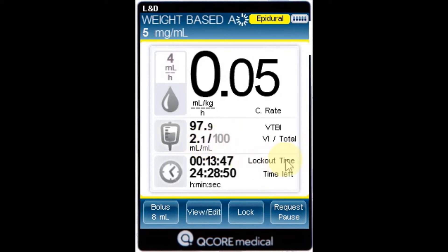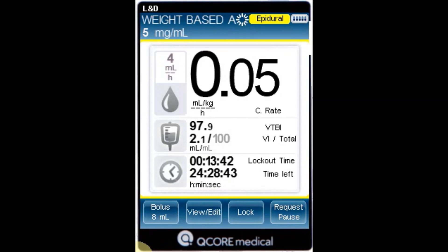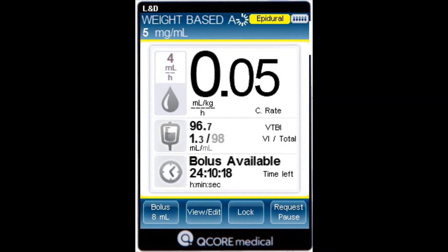Lockout time: the time remaining until the next bolus is available. After the lockout time elapses, the parameter changes to bolus available. Time left: the maximum time remaining until the end of the infusion.